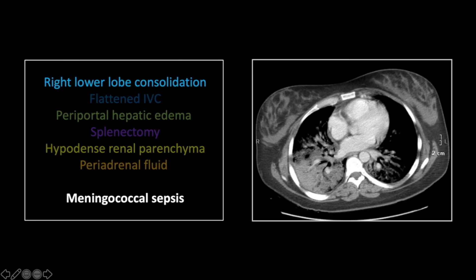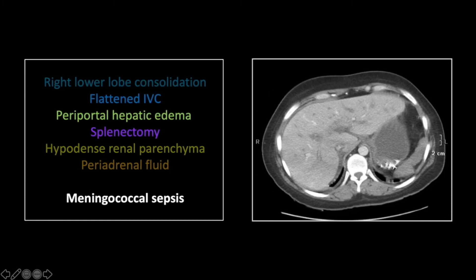That brings us to the final case in this entire series: meningococcal sepsis, or Waterhouse-Friderichsen syndrome. This case, as most do, begins with a pneumonia manifesting as a right lower lobe consolidation. The next cut down shows manifestations of hypoperfusion and possibly resuscitation: a flattened IVC and periportal hepatic edema. Perhaps the diagnostically most important finding is that of a prior splenectomy, as splenectomized patients have an increased risk of infection by encapsulated organisms.